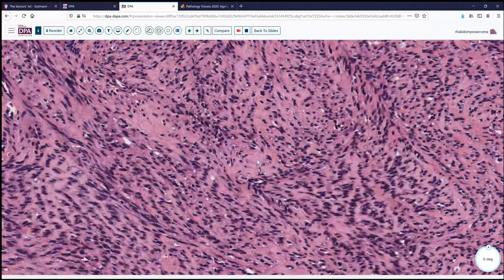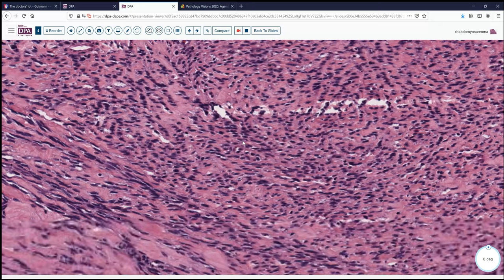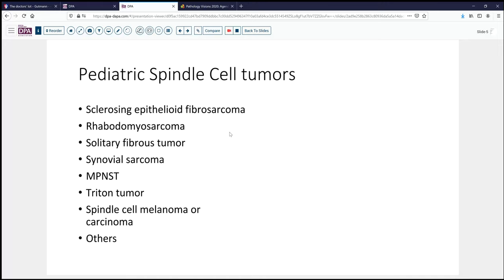With this appearance — a fairly uniform pattern — a number of things come to mind as we consider what this lesion could be and the best classification. If we think in general of pediatric spindle cell tumors, there are a variety of things that may enter our differential. Sclerosing epithelioid fibrosarcoma is fairly uncommon, but something that could have a very fibroblastic appearance.